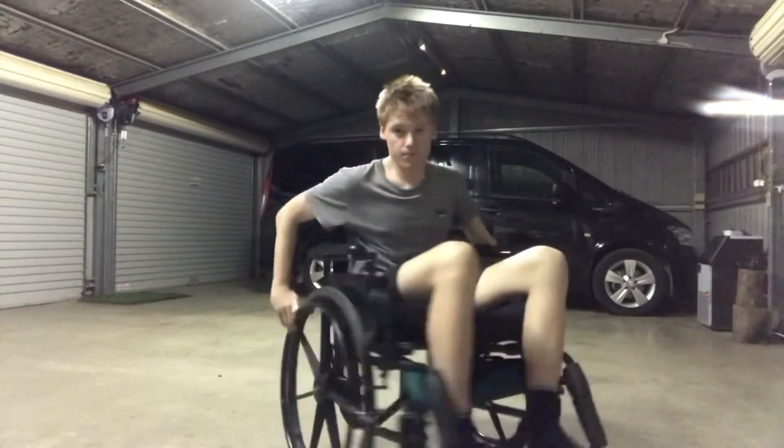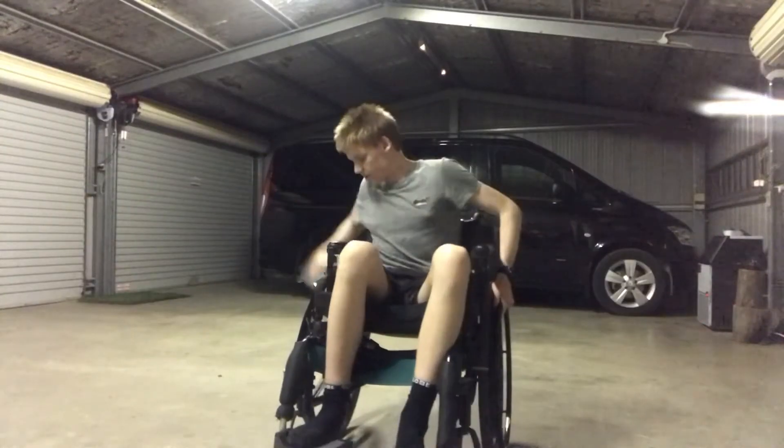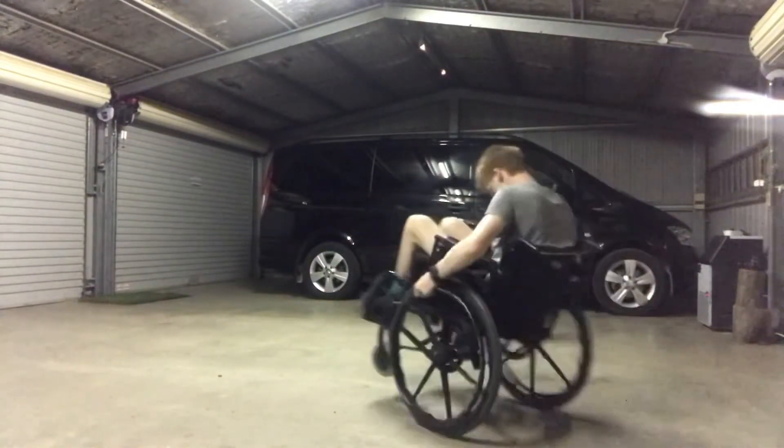Some tricks you can do: around the world, where you lock one wheel and turn the other — keep one wheel still while spinning the other.